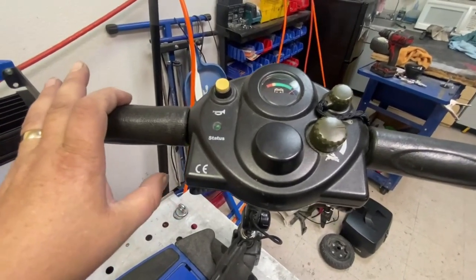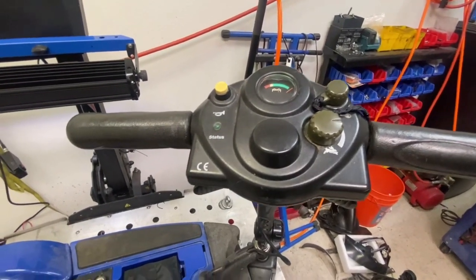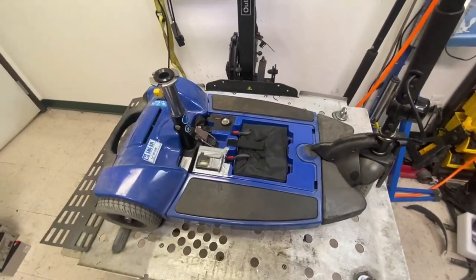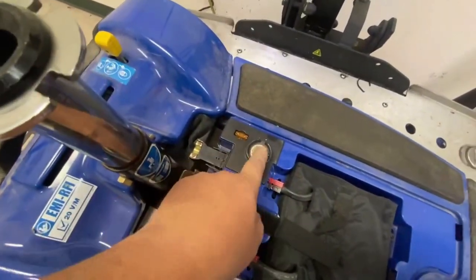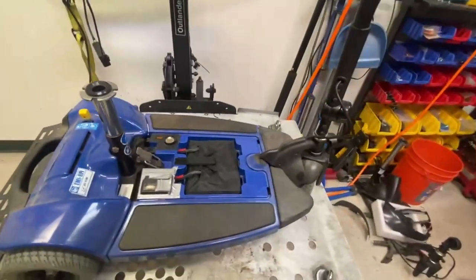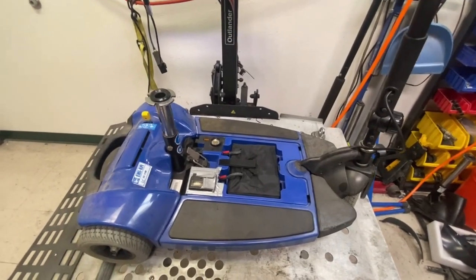Without that indicator light telling me what the problem is, I'm kind of having to guess what might be wrong with the scooter. I've got a good idea what it could be. I've tested the fuse — the fuse is fine. The reset is obviously fine because you've got power at the gauge. So what I'll do is take the batteries out, separate the front and the rear, and see if I can locate where the controller is.